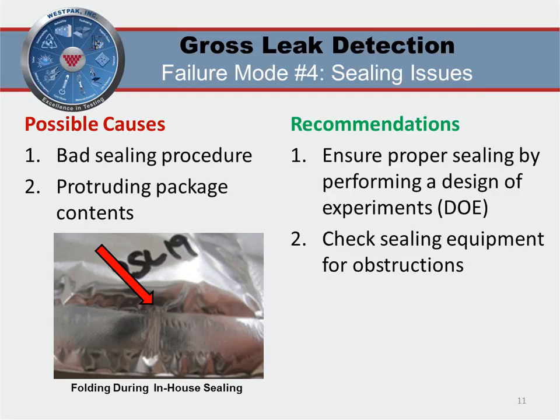So when you choose your aging temperature, you want to know your packaging material and your product material. You just want to ensure that you know the glass transition temperature of your material. So anything higher than that, of course, will be excessive. But if you're at a temperature below the glass transition temperature of your material, then you're pretty good. So it's only excessive if it's product dependent, pretty much. Check with your supplier of your materials. They probably have those properties, so you just make sure you don't exceed those temperatures during aging.